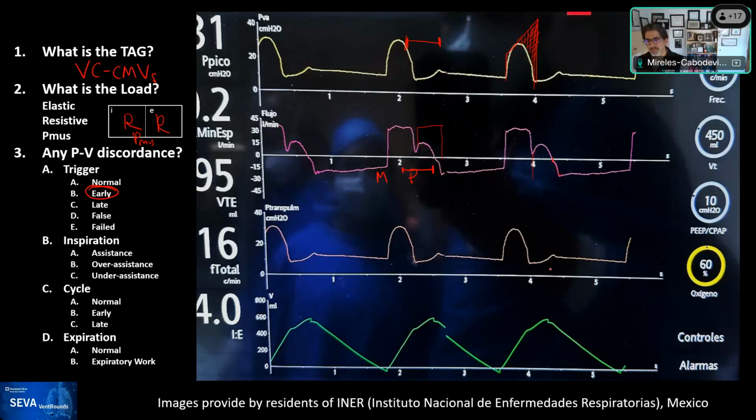It all depends, Rob, I would say, because you're on the expiratory phase, right? So the ventilator is controlling pressure. If it sees the pressure go down, it should give flow to maintain the pressure at that given level, unless your trigger is a pressure trigger, which we have seen that they kind of limit.